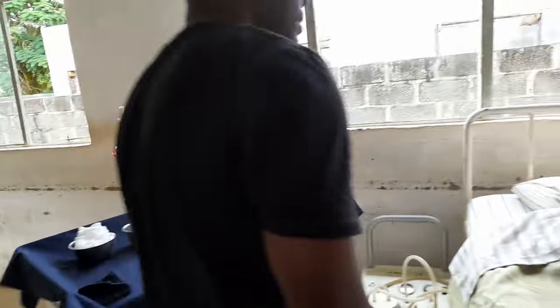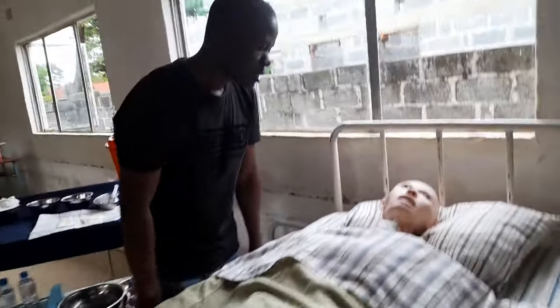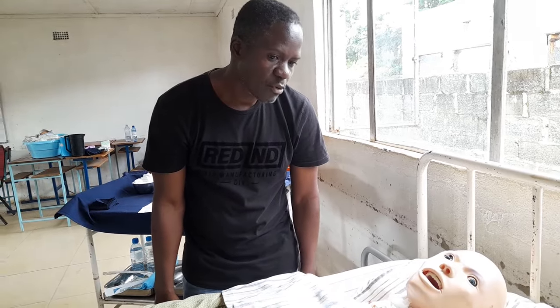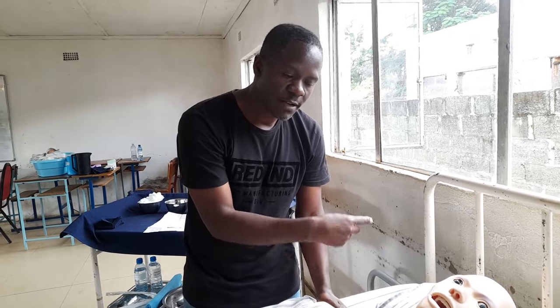We come to the patient — good morning, Mr. Mkuvesa. I am a student from Kalulushi College of Nursing. I've been assigned to do tracheostomy care on you, which means I'm supposed to suction through the tube. Am I allowed to go ahead? Is there anything I can do for you before I begin the procedure? At this moment, Mr. Mkuvesa, I would like to prop you up.